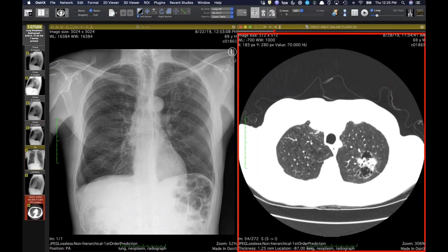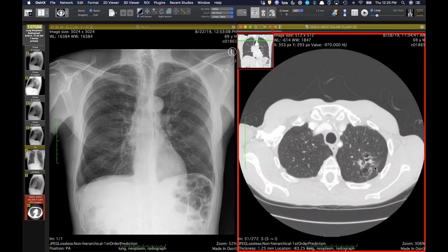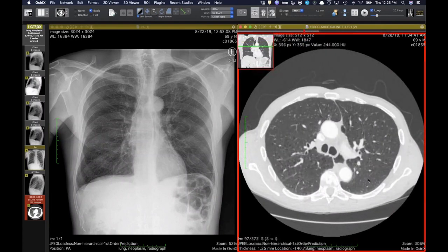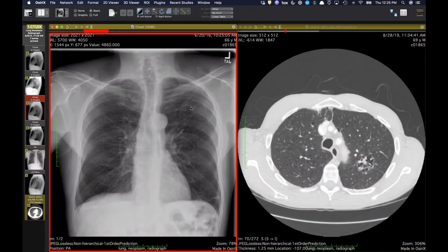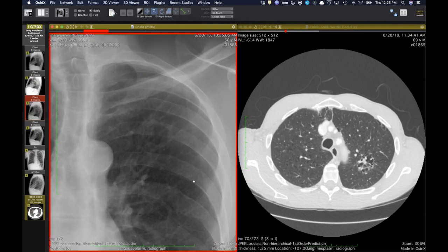So it's not a diagnostic dilemma, but this is a patient with severe underlying emphysema and has this large bubbly adenocarcinoma that's developed over time. And this was actually the soft tissue component. This was watched once, and then it was actually biopsied and confirmed as an adenocarcinoma, more of this superior margin. And I don't remember if he was a surgical candidate or not, just given his emphysema. But I think that even if you go back here, you know, maybe. Certainly not below standard of care to not see that thing, but I think that's probably what it was. So just a nice eye test over the course of several years of a developing adenocarcinoma.